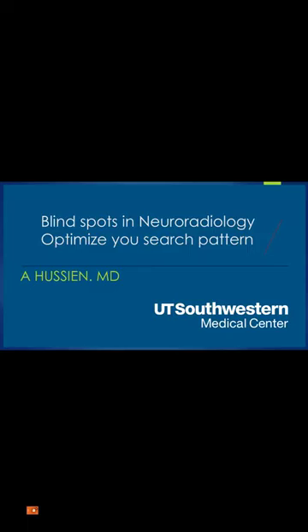In a talk, I put this in a talk, and actually this is not all I have. I have more than that, but for the time constraints I just put the most important portions of common misses in relation with the search pattern in neuroradiology.